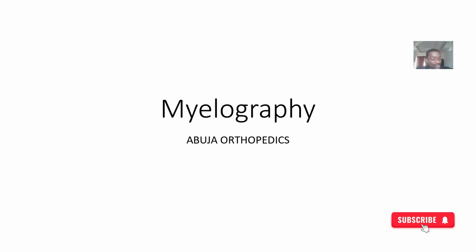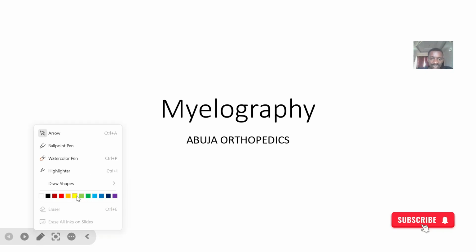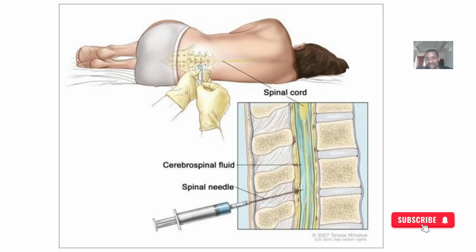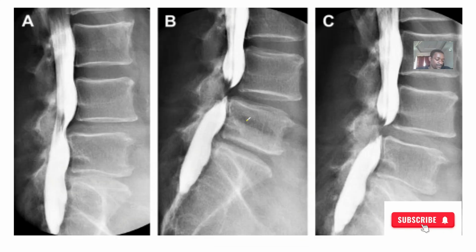Now we are trying to look at the next imaging modality as related to orthopedics, of course. So we'll be looking at what is known as what? Myelography. Right? So of course you know that was the spinal cord stuff.